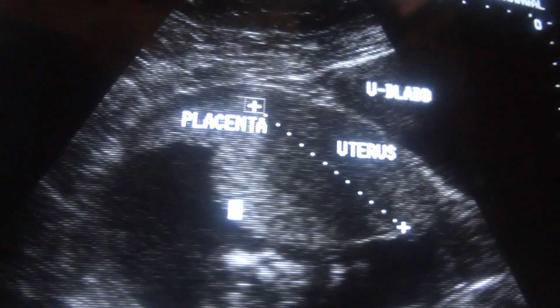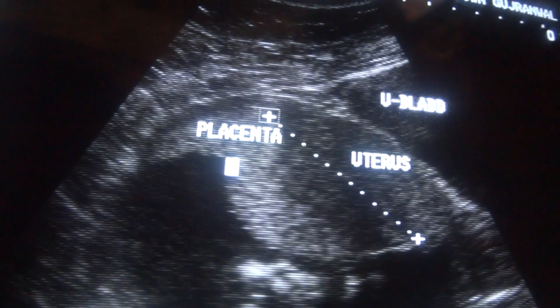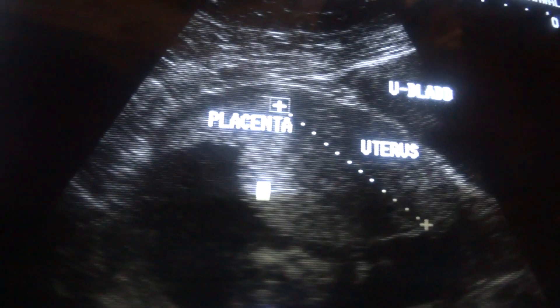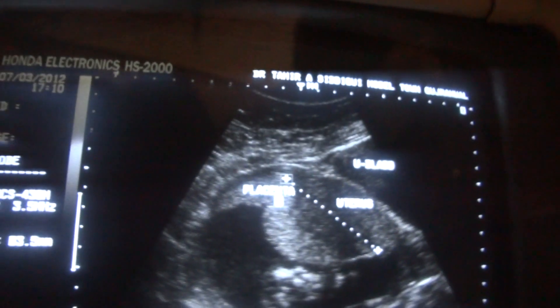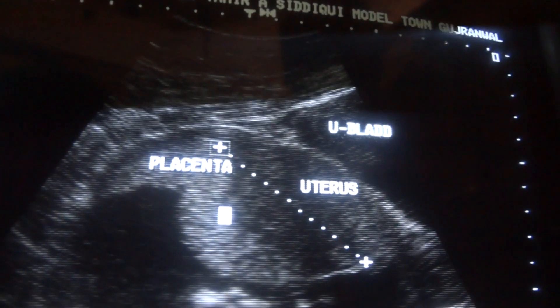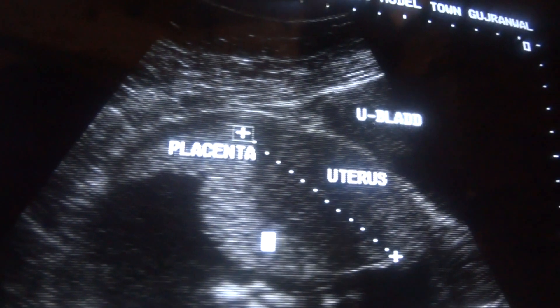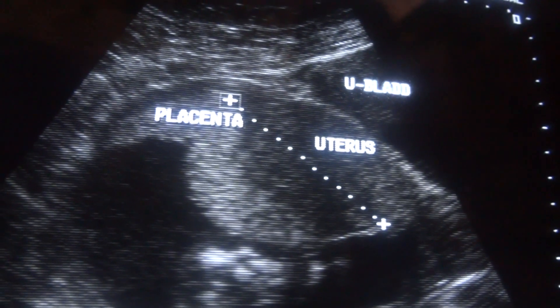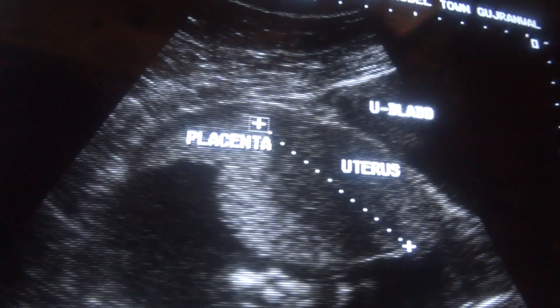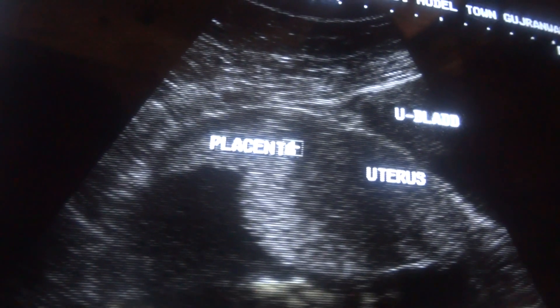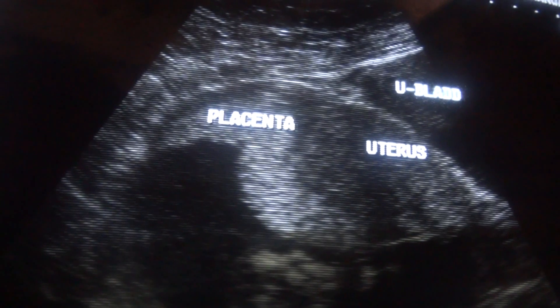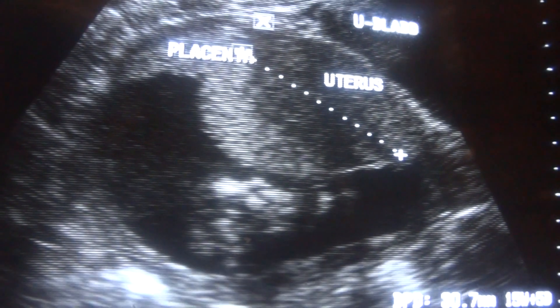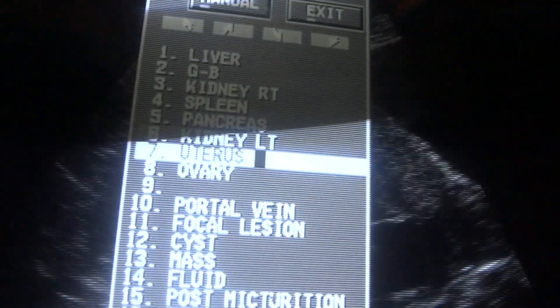Now the question arises: why is this placenta, that is with the anterior wall of the uterus, being depressed in this region? It should have been going straight, but from this region it is going downwards, making a curve. This is because of Braxton Hicks contraction. If there had been no Braxton Hicks contraction, the uterus would have been seen from this interface to this interface.